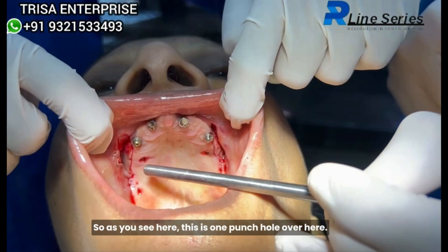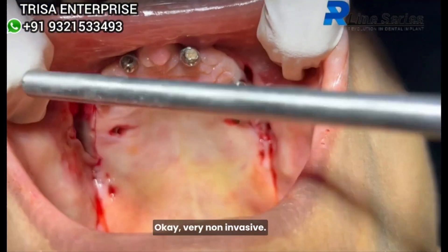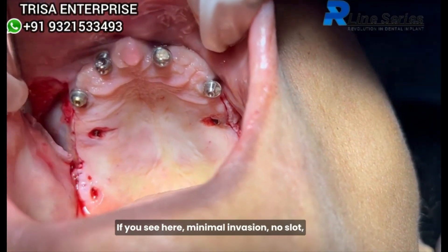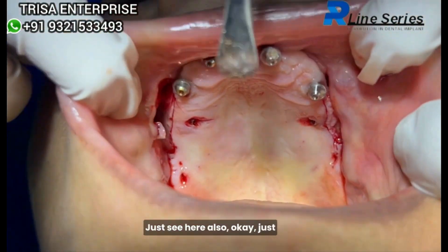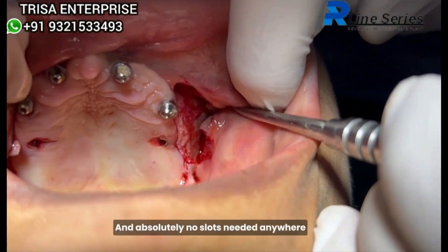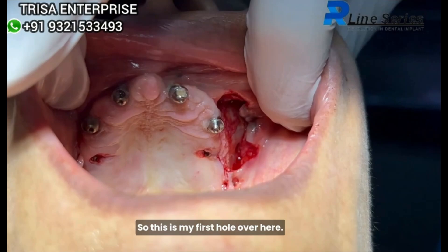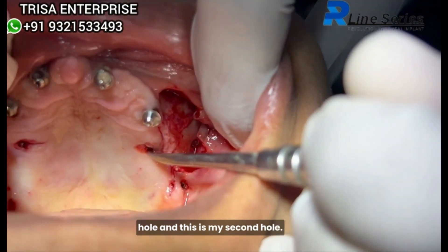As you see here, this is one punch hole — very non-invasive. Minimal invasion, no slot, no bleeding — just one tissue hole, and absolutely no slots needed anywhere to place the zygomatic implant. This is my first hole and this is my second hole.